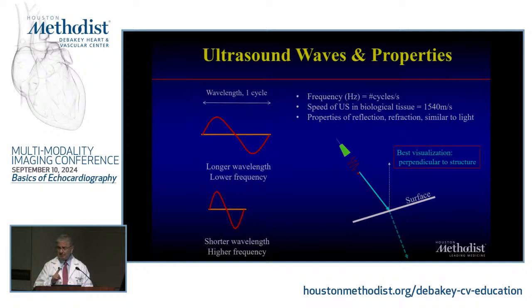And remember, for those of you who know, it's opposite to Doppler. With Doppler, the best signal is when you're parallel to the structure. For imaging, the best signal is perpendicular to the structure. Okay?